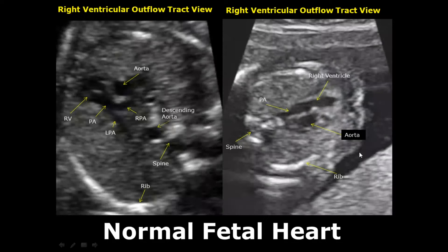In the right ventricular outflow tract view, we can see the right ventricle and the main pulmonary artery, along with its branches — the right and left pulmonary arteries. Part of the aorta is also seen.